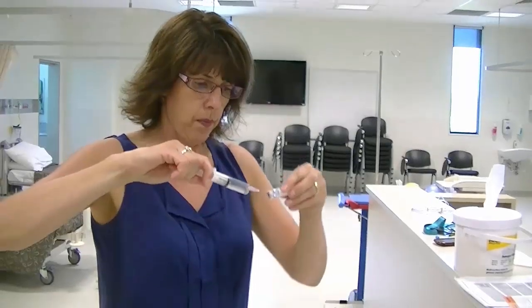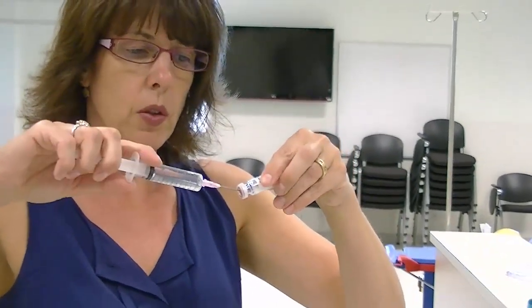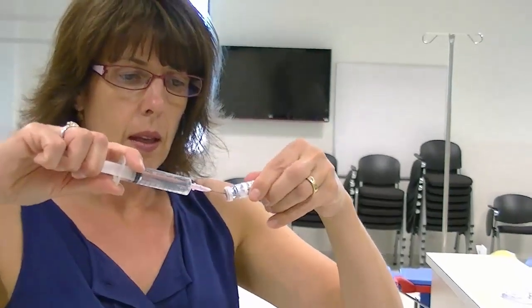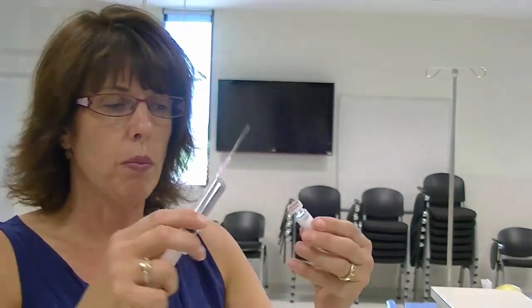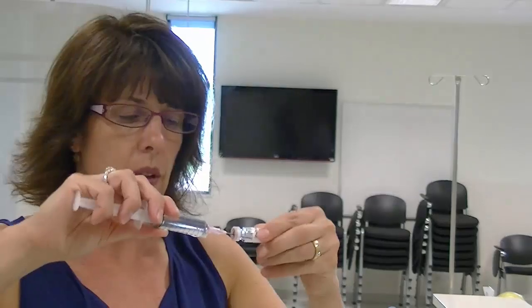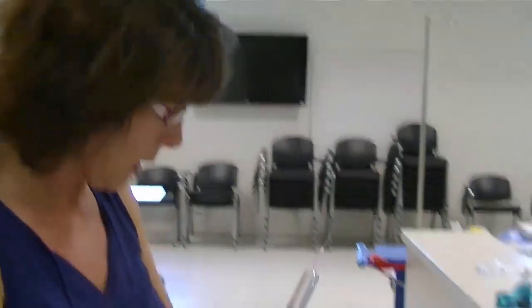If I was to lose drug, as in spill it, I would start again. A drip is not going to make much difference, but if I was to lose a lot, it would. So I've made sure I've got all of that.